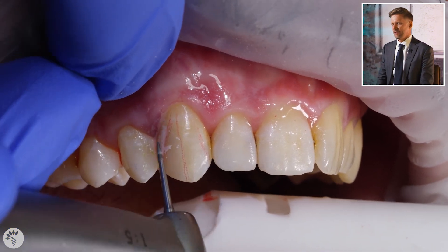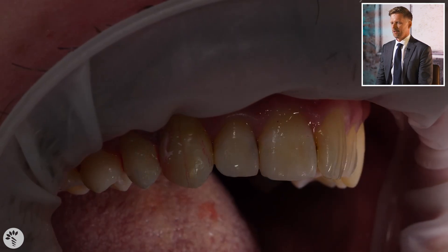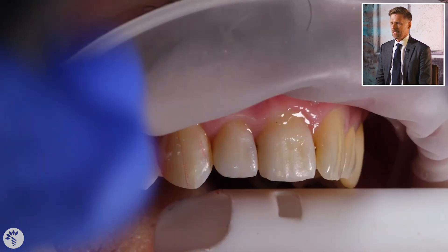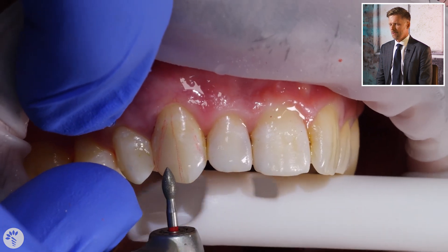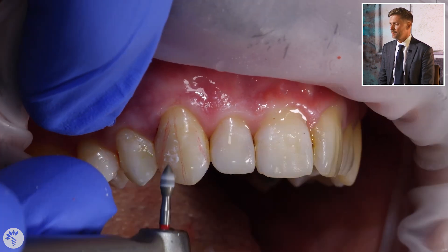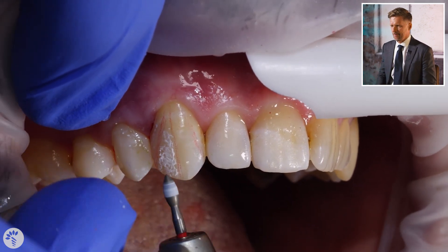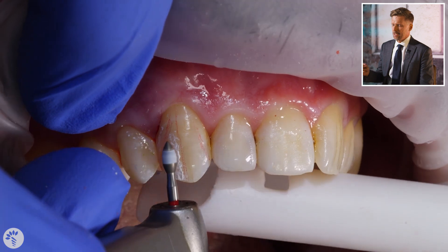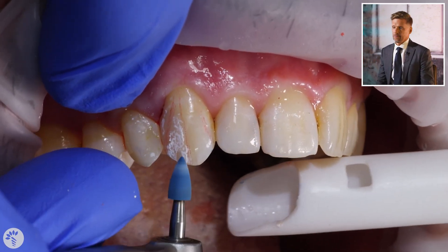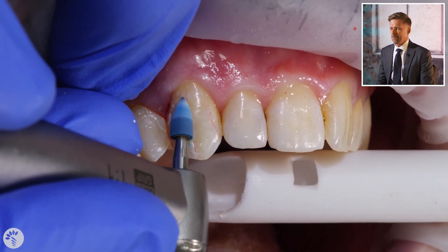In this case I want to put a little bit of texture and a slight dent in there. I'm using a rubber point or a stone to do that because it generally creates texture with less scratching. If that's too slow we can use a bur, but burs tend to leave scratches that are too heavy — not natural like perikymata. They look like someone just put fake scratches in, which they did, but it doesn't look like nature, so we want to soften those out.